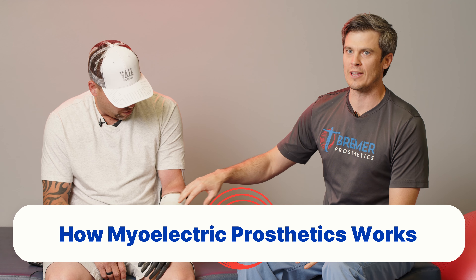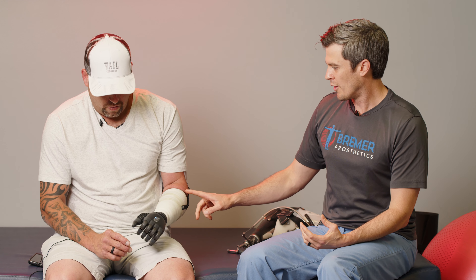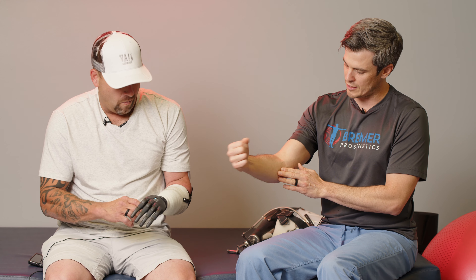There's still musculature in his limb. What happens is when the nerve sends a signal to that muscle to open or close the hand, there's an electrical impulse that goes through that muscle. There are small sensors inside the prosthesis, inside the socket here, that pick up that impulse. So as Jesse moves the muscles that would extend his wrist or open his hand, when those flex it sends a signal to open the hand. And when he moves these ones here, it sends a signal to close the hand.